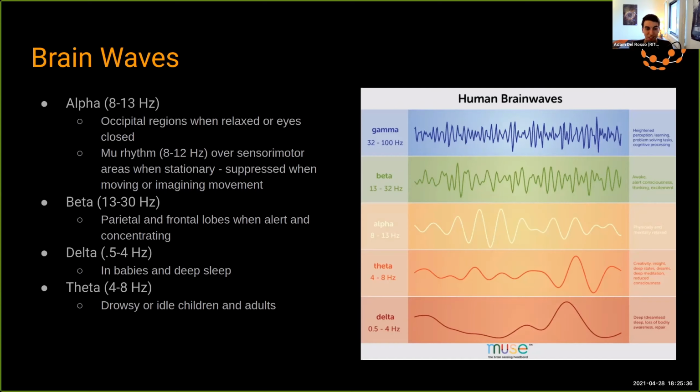And so there are actually books just filled with different waveforms, effectively, from EEG data that try to determine what might be going on. So, anyways, these are the different classifications of brain waves to different frequency ranges. I would warn that with these alpha, beta, delta, they vary from study to study sometimes. There's actually a review paper that goes through and looks at how these vary. So they're not terribly consistent. So when in doubt, I would look more at the actual frequency rather than those names.